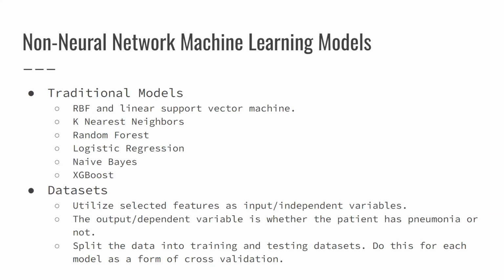Now, that was one methodology. I'm using another methodology to predict pneumonia or not pneumonia. Specifically, if you remember before when I was doing the feature extraction with pyradiomics, this is what I was using it for. Instead of taking in input images, I'll be using actual numerical data.